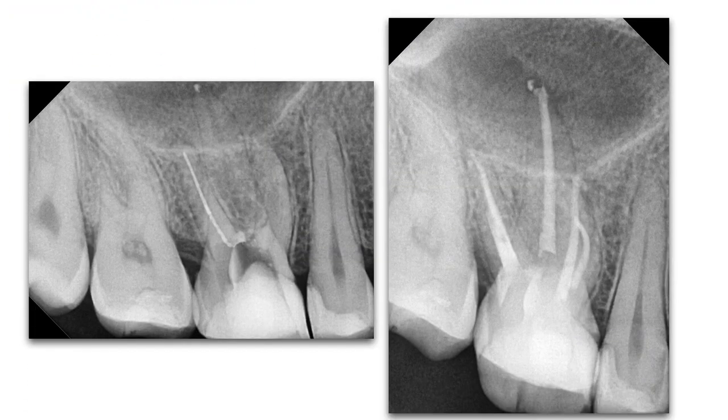So here the preoperative and here the postoperative, and you can see the area of the perforations, the good sealing of the tooth, and it is all because we are using a dental operating microscope or magnification. We are able to easily control the case and manage the cases or complications.